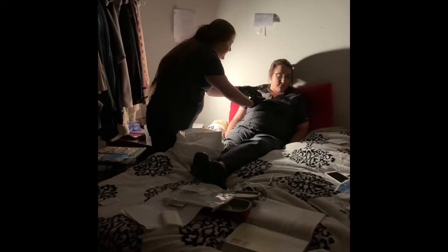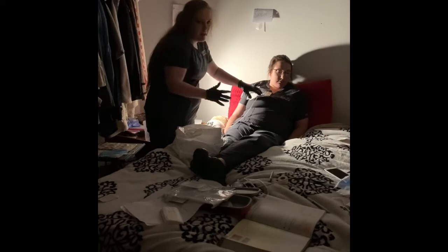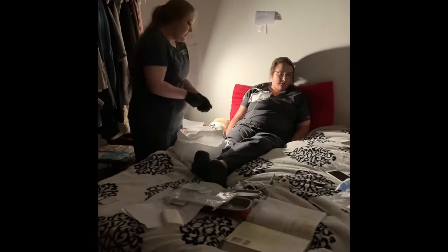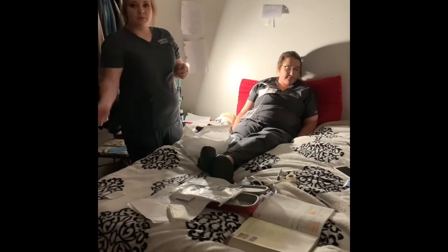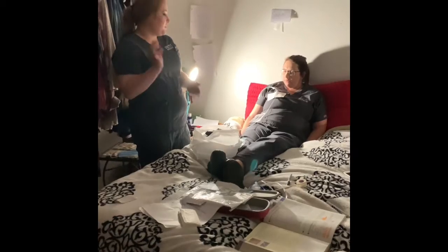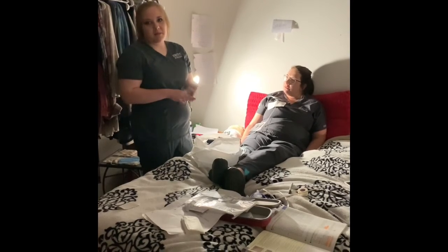I would press it down, ensure that I didn't have any air bubbles. I would make sure that the line wasn't pinched or anything like that was going on under there. Once it had been applied, I would then take off my gloves. I would just document on the central line itself. I would document who applied it, the time and the date.